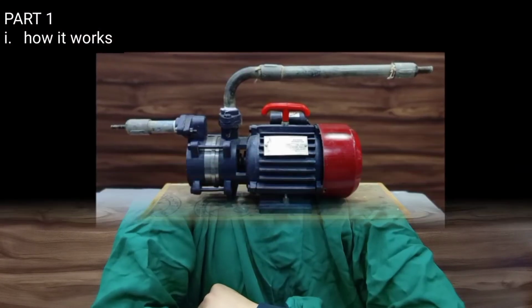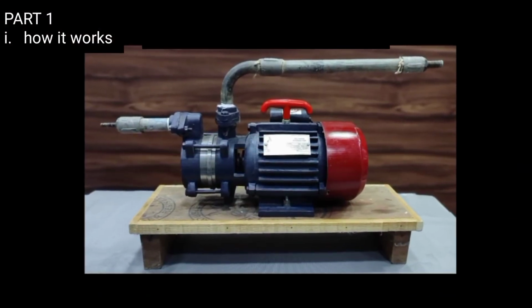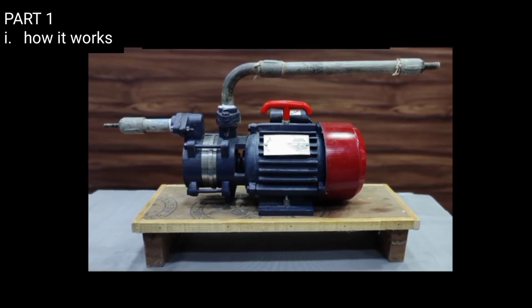Let's begin. First point is how this motorized suction works. This is the picture of the motorized suction that I will be talking about in this video. This is my motorized suction. I have been using this motorized suction for 10 years.